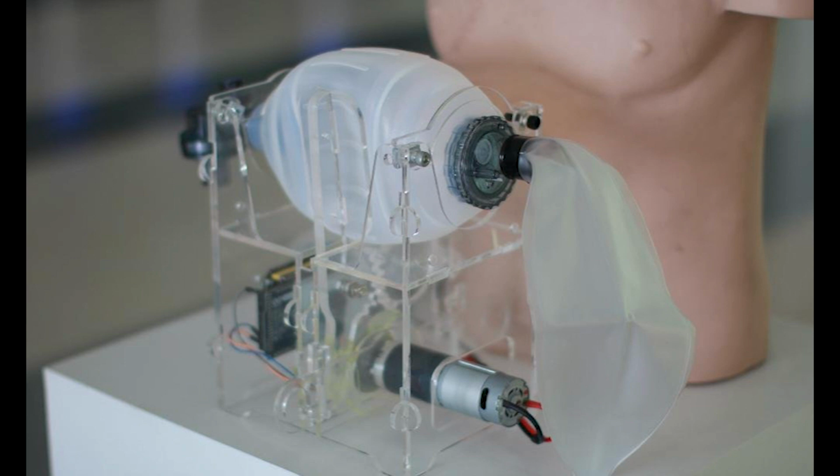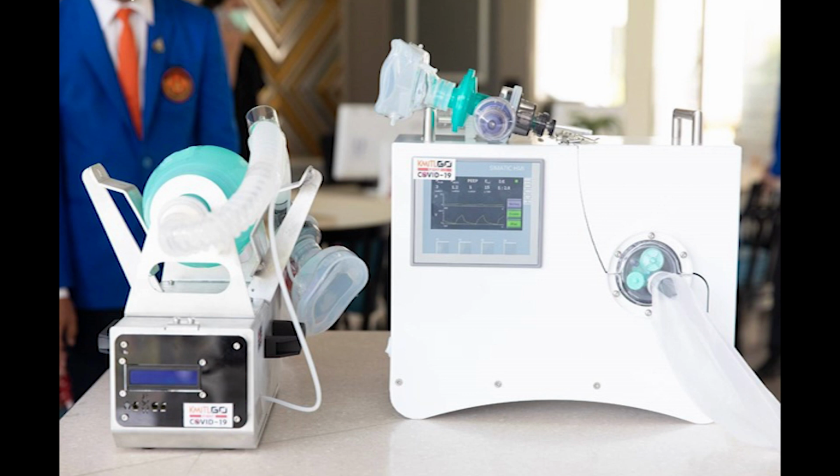An E-ventilator, or emergency ventilator, is a miniature-size mechanical ventilator, easy to carry, small, and saves a lot of space. Although its function still cannot cover all of the mechanical ventilator, it has all the important functions that can be used in moderate cases of patients.